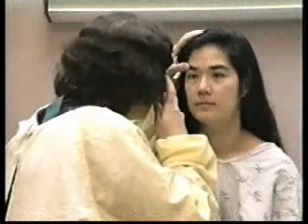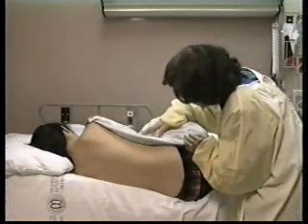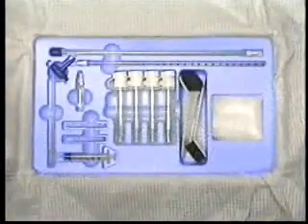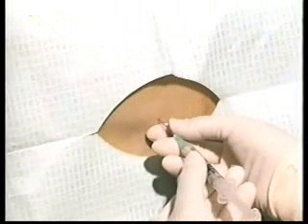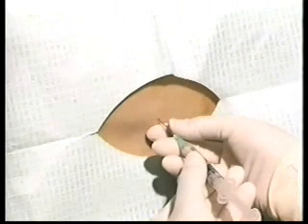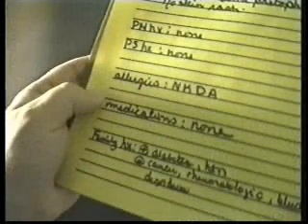The lumbar puncture is one of the easiest procedures to perform. You must know the indications, risks, and possible complications. Checking for papilledema is essential. Make sure that you and your patient are comfortable before starting. Have all materials on hand. Be sure to position your patient correctly, spine aligned, shoulder and iliac crests perpendicular. Enter just below the spinous process. Label the samples in order. After checking your patient, follow up on your results and be sure to document the procedure thoroughly.